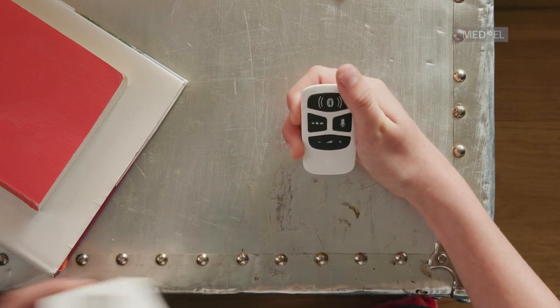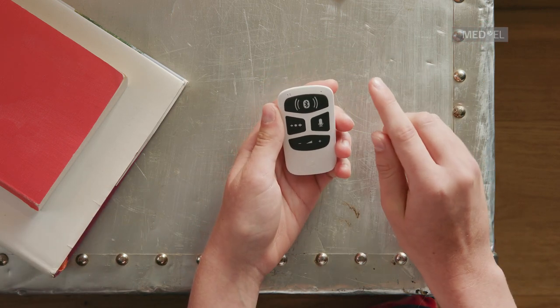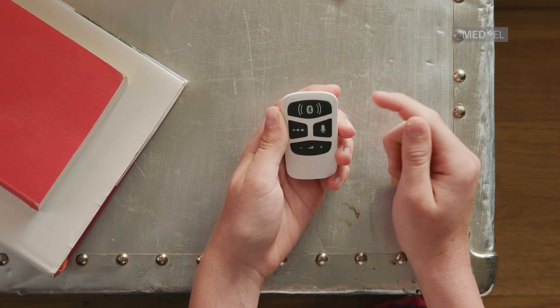Before using AudioLink, you have to pair it with your audio processor. First, switch on AudioLink by pressing the main button for two seconds. The light will indicate it is on.